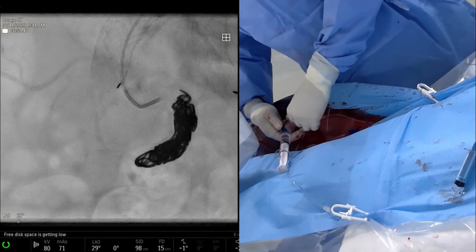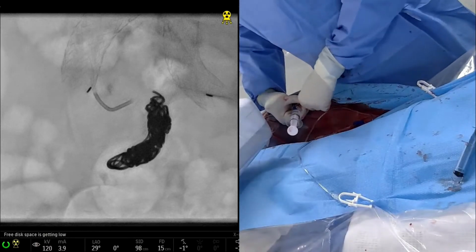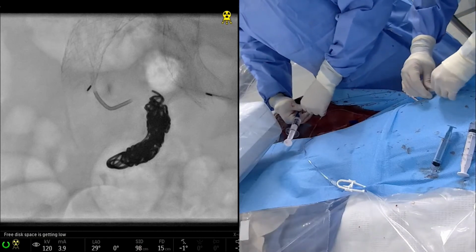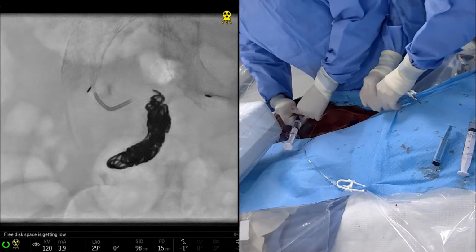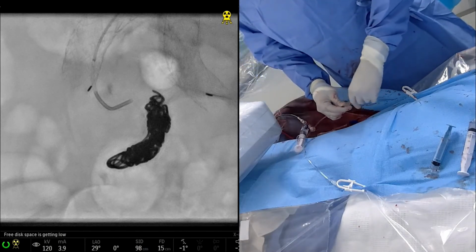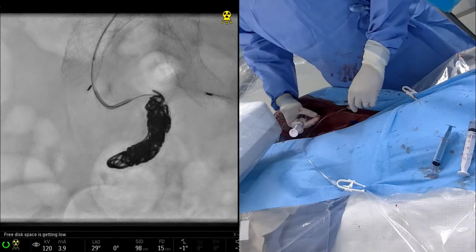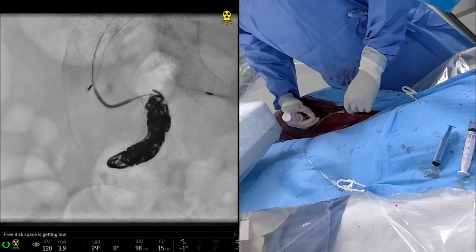So now, here we're just. If the patient's on warfarin and the INR is high, is there anything different you do with the radial access or cocktail? Nope, we keep it the same. We haven't published specifically on blood thinner safety, but we have on patients with high INR and low platelets, and we haven't had any issues. How low a platelet will you go to? Unless they're actively bleeding, we've run with it.